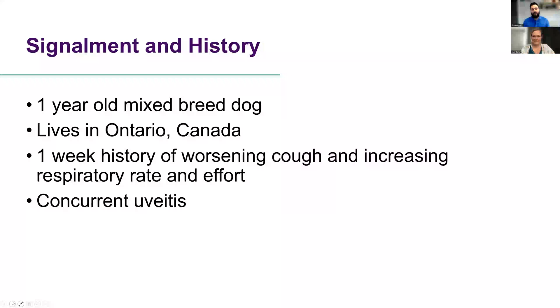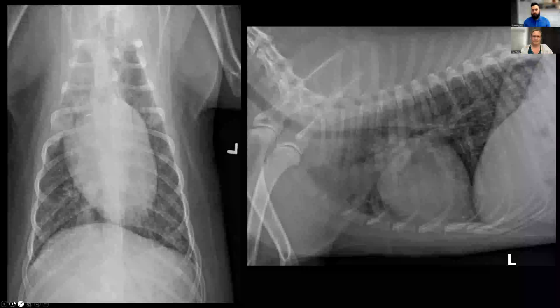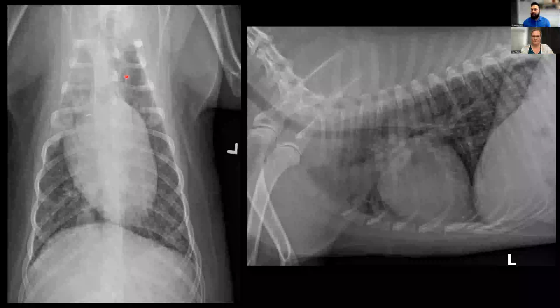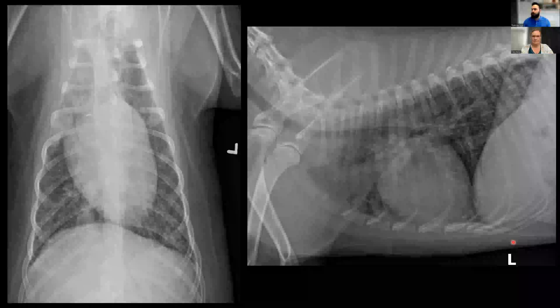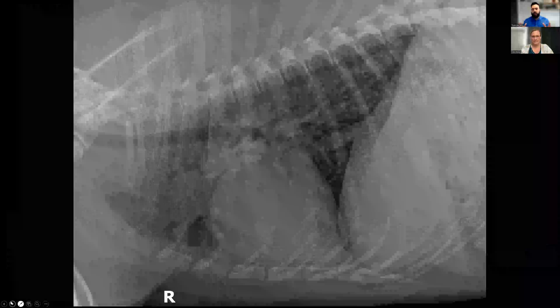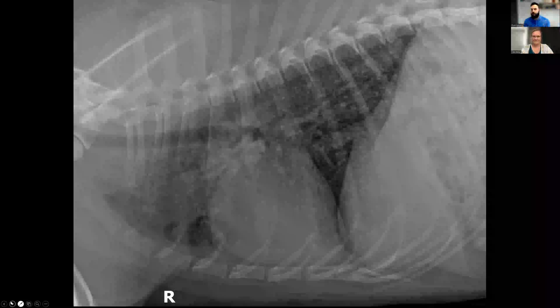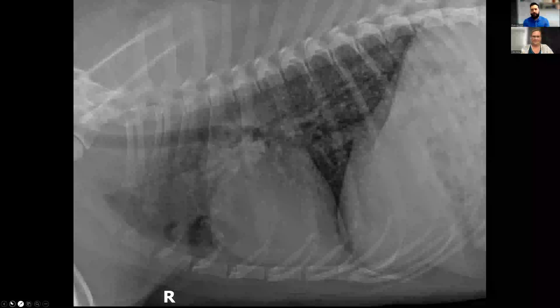This patient also has concurrent uveitis. Because of that increasing respiratory rate and effort, we took radiographs as part of the baseline diagnostics. On our left-hand side of the screen we have a dorsal ventral projection, and we have our left lateral projection. No set of thoracic radiographs is complete without that right lateral projection — we have complete three-view thoracic radiographs, which is ever so important.